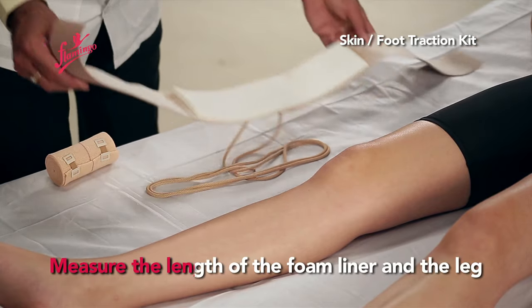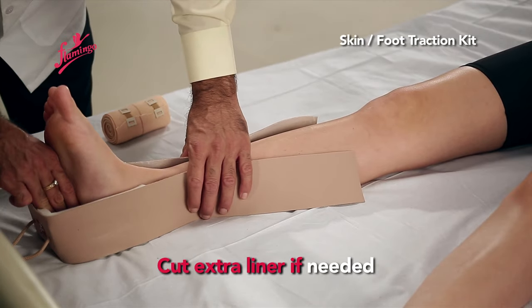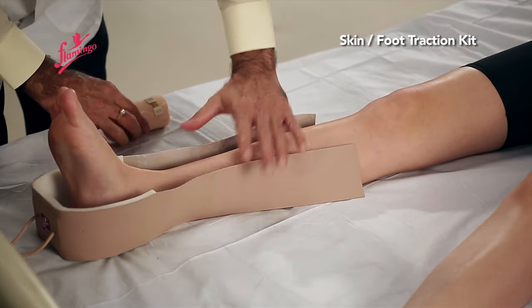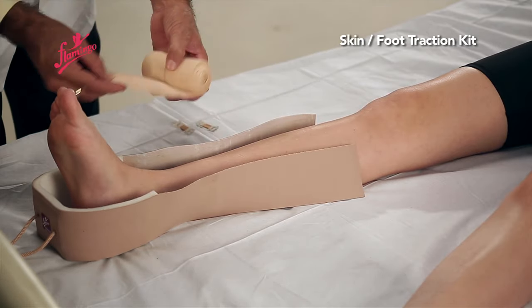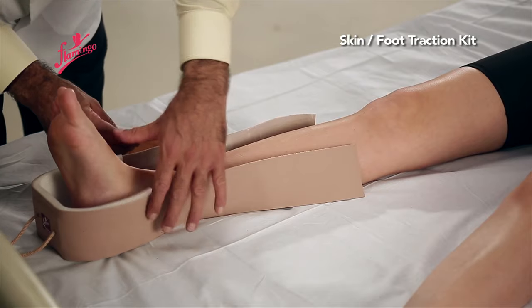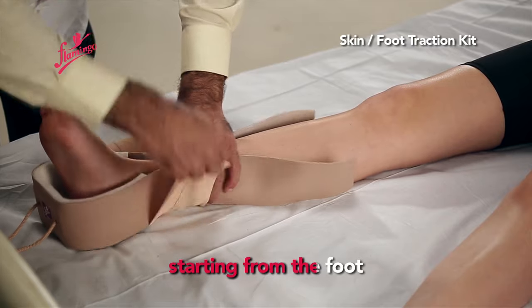Measure the length of the foam liner against the leg and cut any extra liner if needed. The crepe bandage is then wound around the liner, starting from the foot.